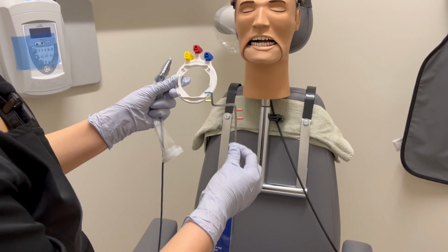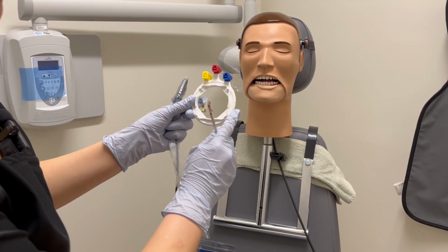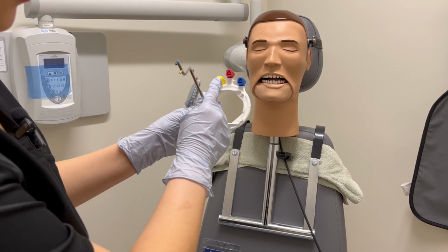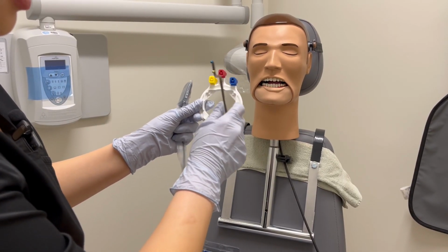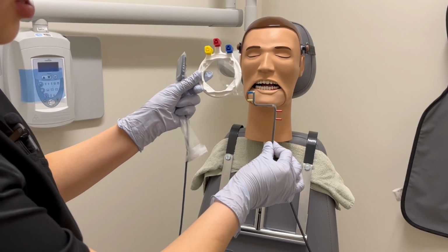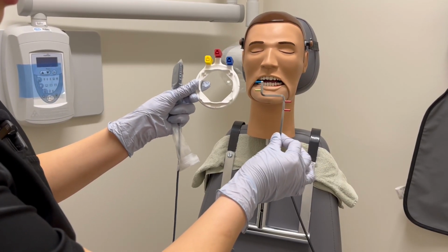Armamentarium for the universal RINN beam alignment device will include a white plastic ring that has 3 colors: yellow, red, and blue. It will also include the indicator arm that has also 3 different colors: blue, yellow, red.